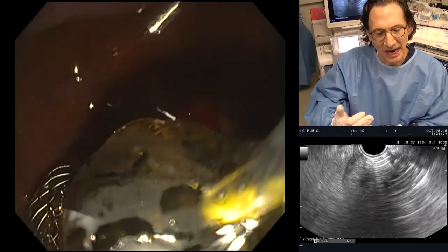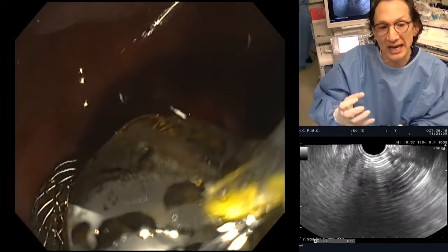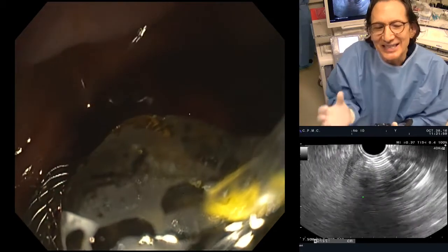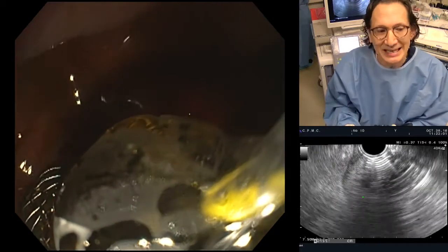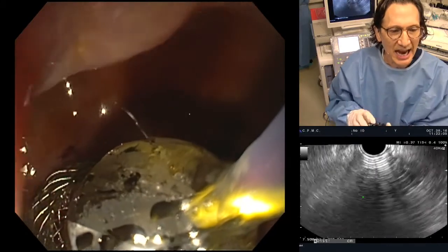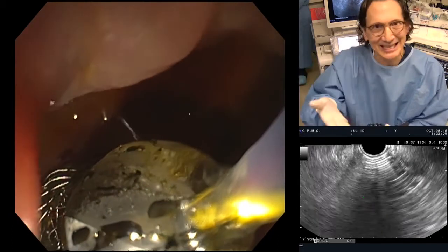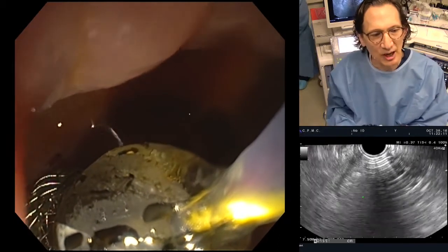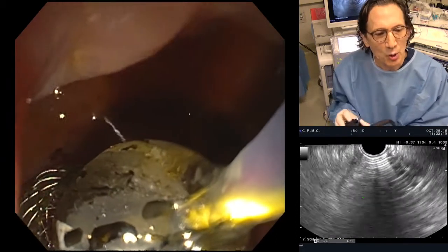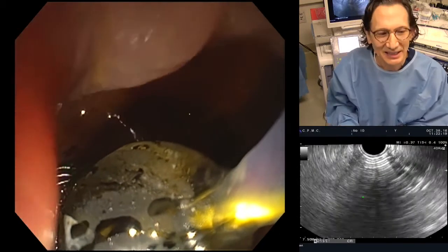And I could tell you endless stories of the development. We had dog bone-like balloon catheters. We had all sorts of different devices that we had created that we thought we might need. It turned out we ended up not needing that, and we can use an off-the-shelf device. This is a CRE balloon. This is not designed for dilation of a transluminal stent, of course, but it works just fine. So there's no need to develop a dedicated balloon, but we actually did develop that.